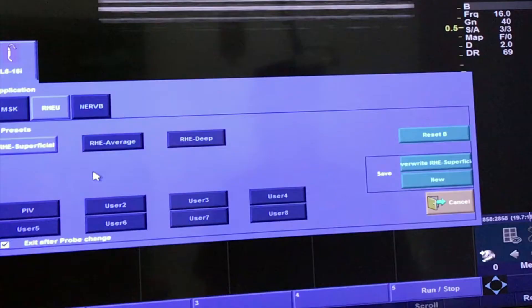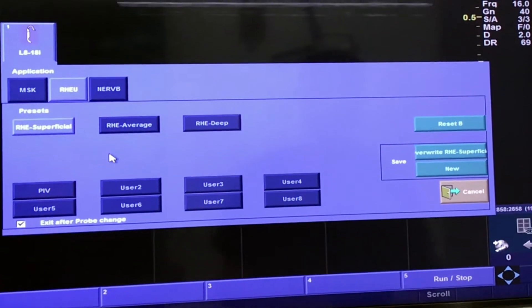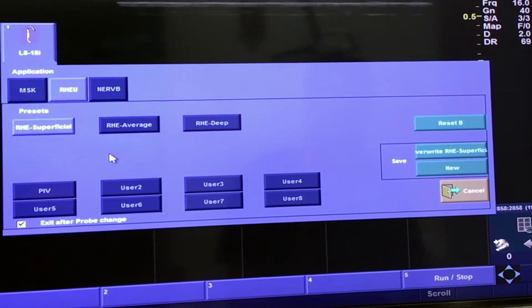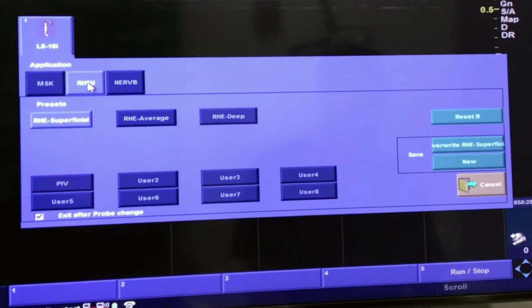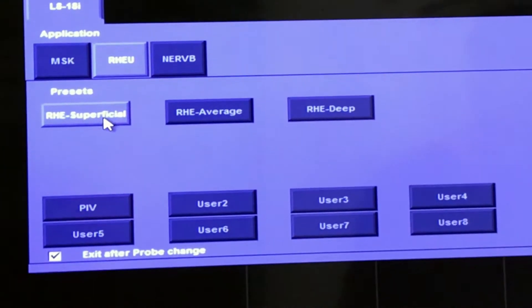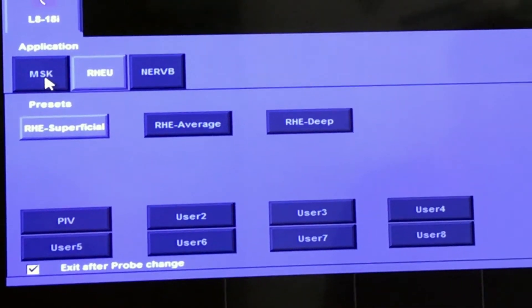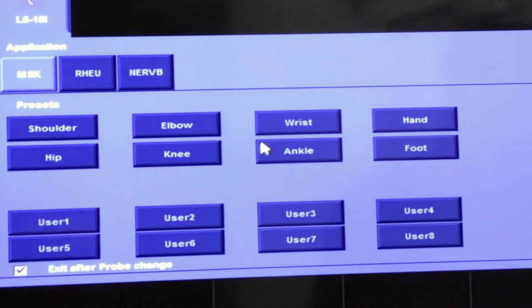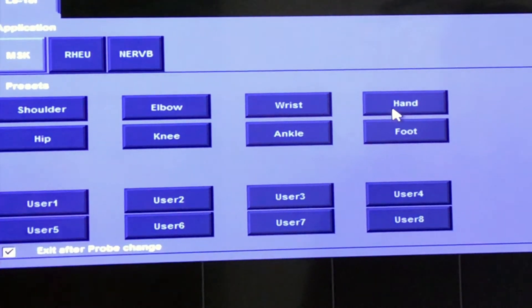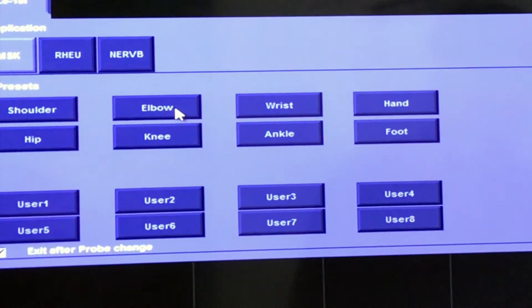These are the preset exams that are in most ultrasounds. What I use mostly is the rheumatologic superficial setting, but I also use the MSK — musculoskeletal — setting for the wrist, hand, ankle, and sometimes the elbow.